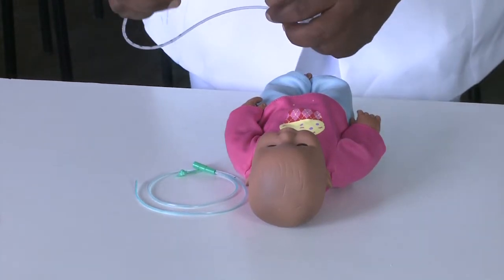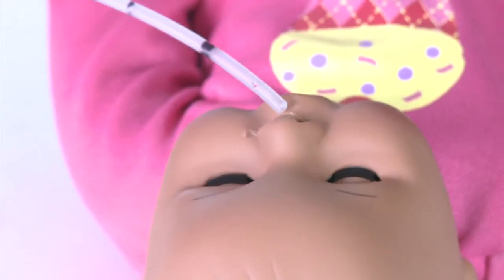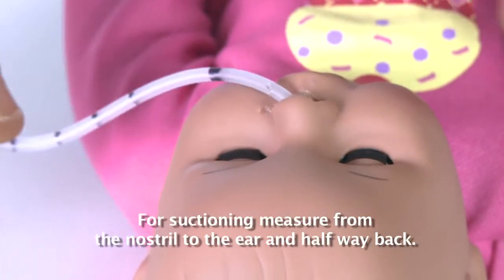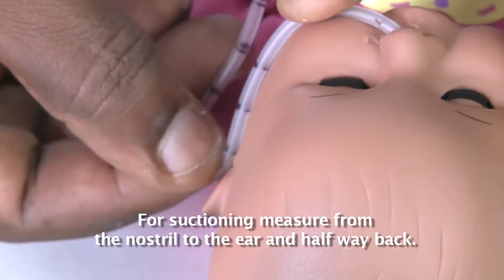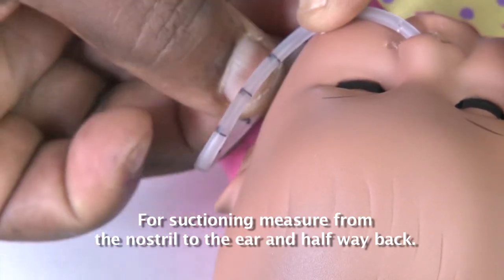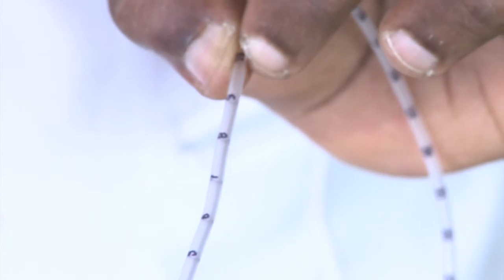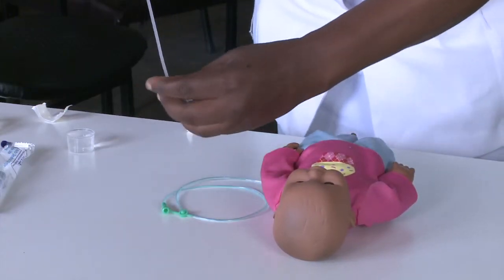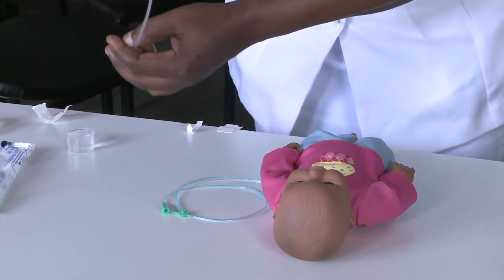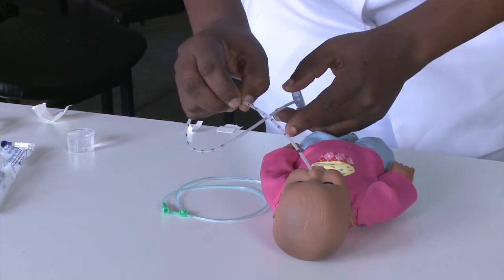First of all, I'm going to measure from the nostril to the ear, then halfway. So the length that I have is the length that will go inside the nostril of the baby when suctioning. I'll start suctioning. This is connected to the suction machine. I'll start in the nose.